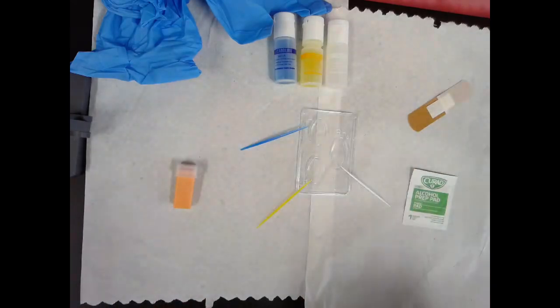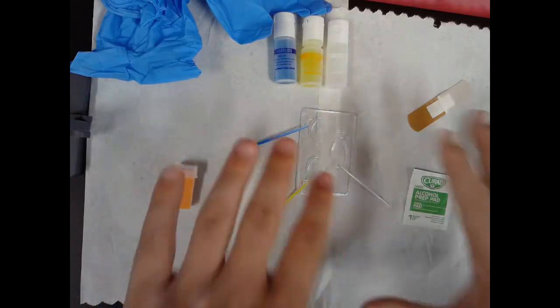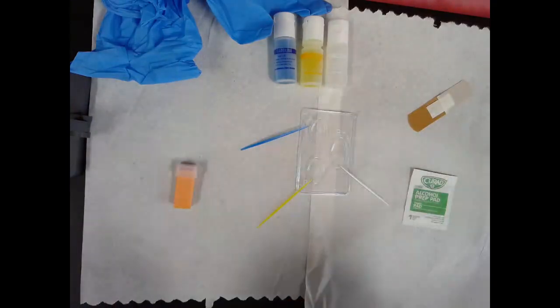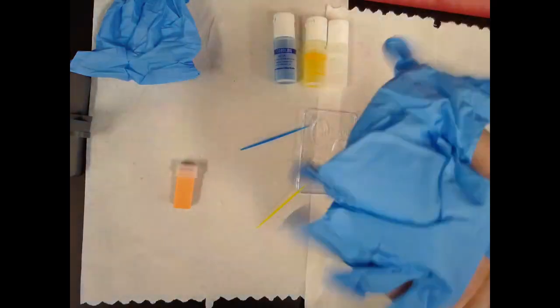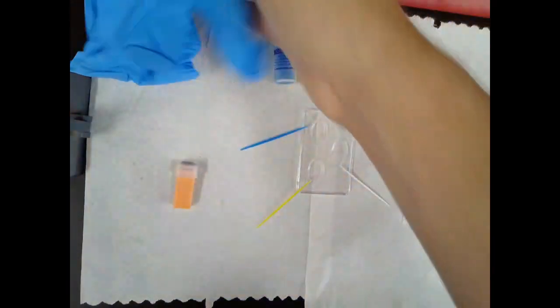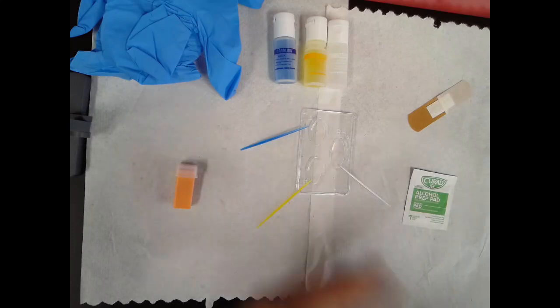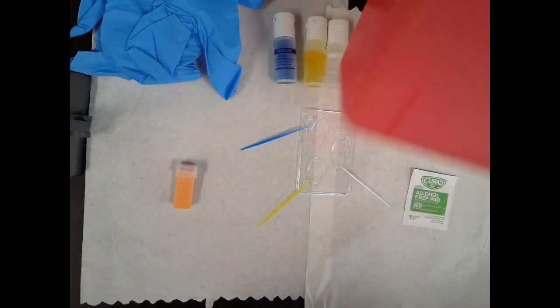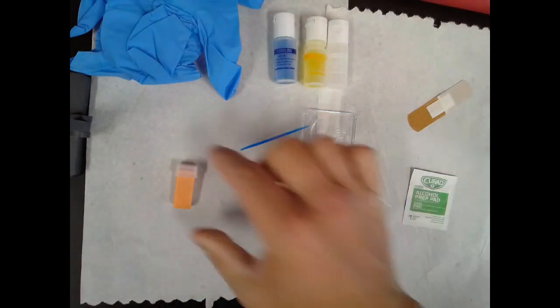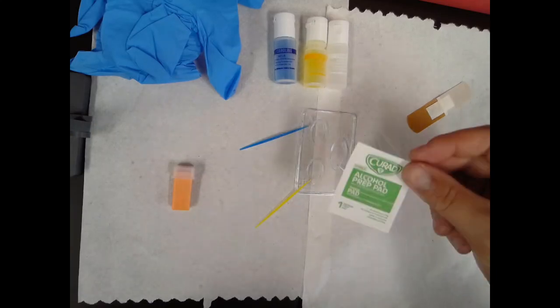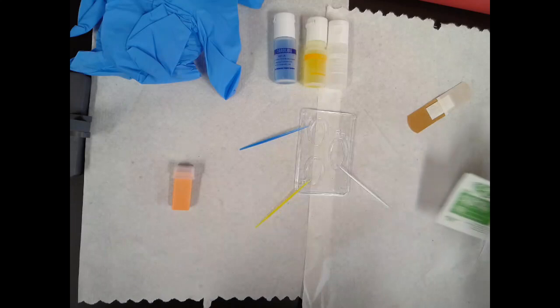A few things that should be necessary for something like this. I usually like to put a piece of paper towel underneath this basin here because it just helps see better. A few other things you should have handy before you do this is first and foremost, always exercise universal precautions and have gloves, especially when you're doing this on other people. We're talking about poking fingers, getting blood out. If people have transmissible diseases, we do not want those to be moving around.